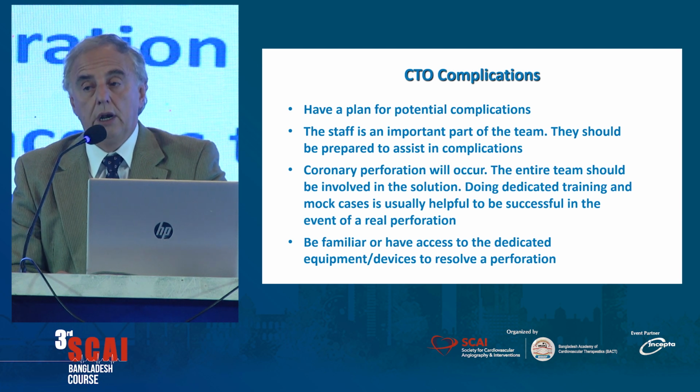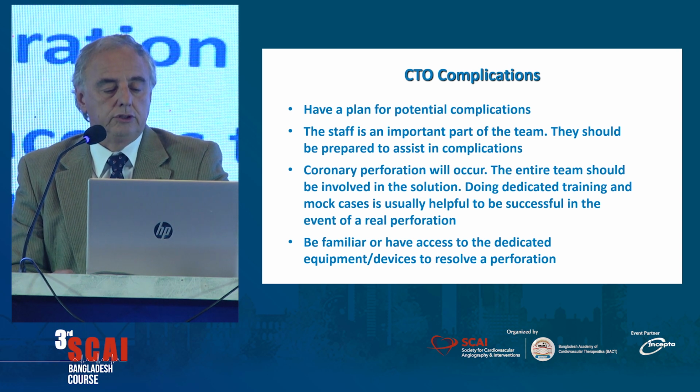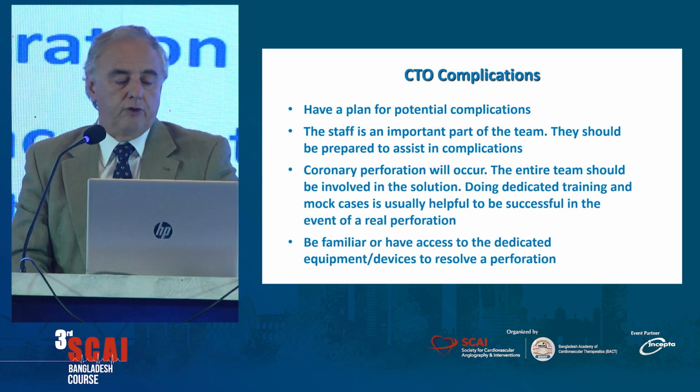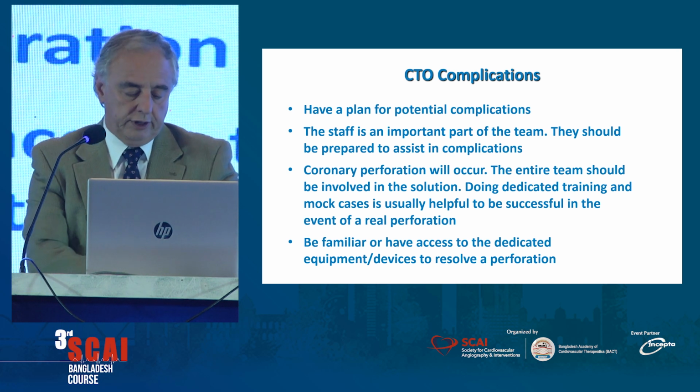Coronary perforation will occur. It's not a problem. It will occur. The entire team should be involved in the solution. Dedicated training and mock cases usually help for the real case, and be familiar with and have access to dedicated equipment and devices to resolve perforations.